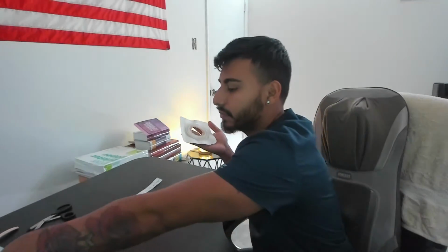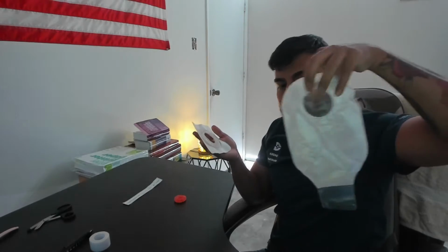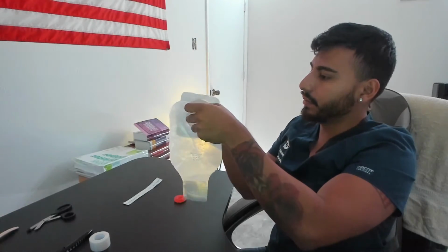Once it is completely smooth, I would get my ostomy bag and I would attach it to the bag.